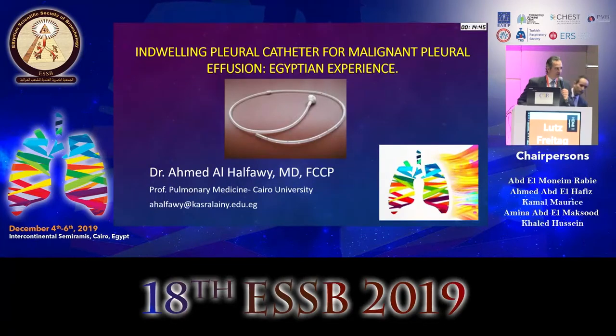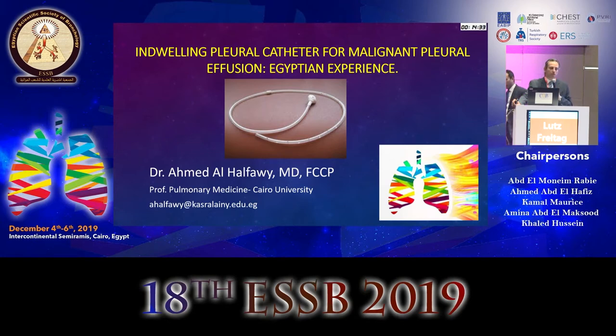Bismillah ar-Rahman ar-Rahim. Thank you very much, Dr. Adel, for the introduction, and thank you everyone for attending the meeting. I'll try to be as quick as possible to catch up with time. The guidelines for the management of malignant pleural effusions entail that the best practice now is to insert an indwelling catheter, a catheter that is placed, and the patient can go home on domiciliary treatment, then he can aspirate the fluid at home.